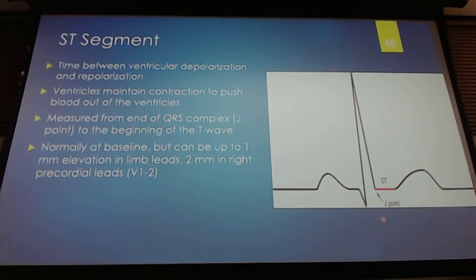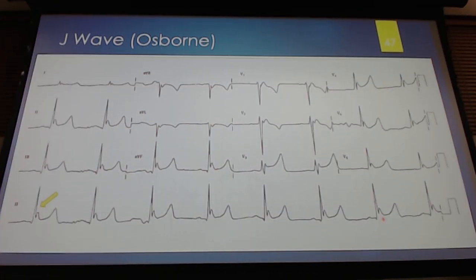So R prime is one that's not going to be that low down. This is really, you are finished with that QRS complex, and now this is something hanging on to the bottom. So R prime is going to come up, it may come down a little bit, but then it's going to go right back up. This is just like a little thing, and R prime is still an R wave and still ventricular depolarization, so you're still typically going to see that sharp up, sharp down, as opposed to very more smooth.